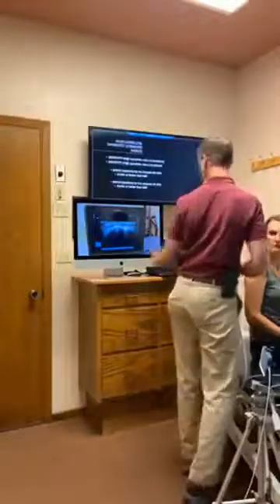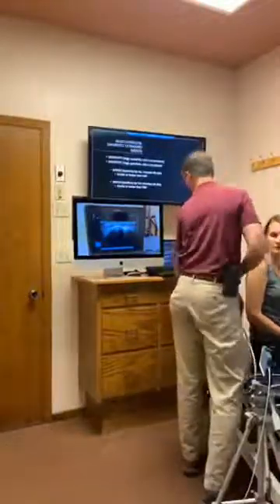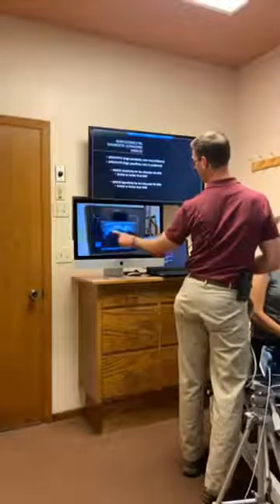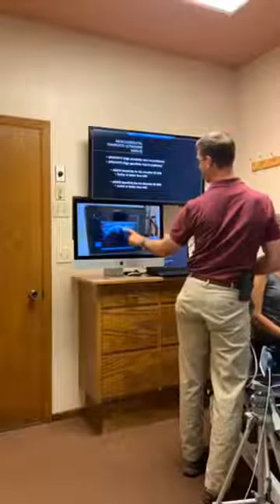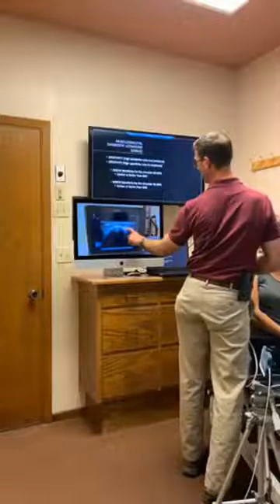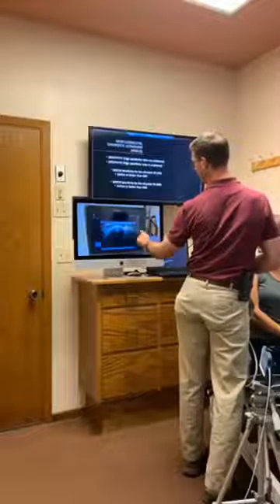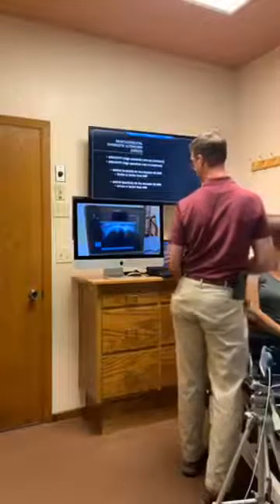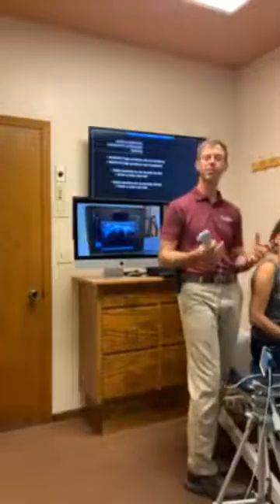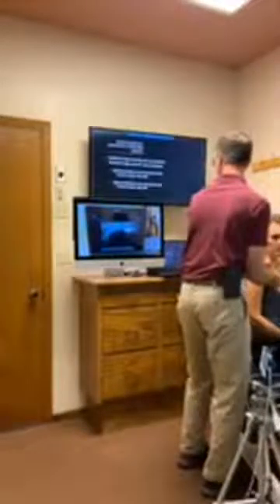All right. So you can see on this, the tendon is this hyperechoic white area. You see the outline of the bone. And then you can see this hyperechoic area sitting nicely in the groove that it's supposed to be sitting in. That's a normal tendon. It's hyperechoic, it's nice and bright. Okay, now what we're going to do is we're going to look at it long axis.